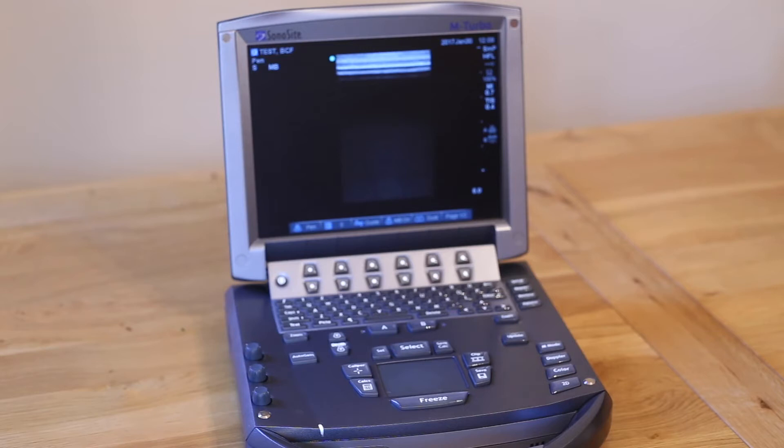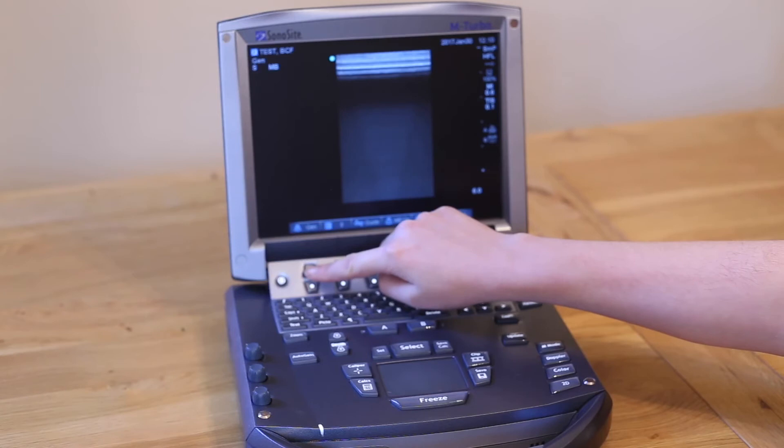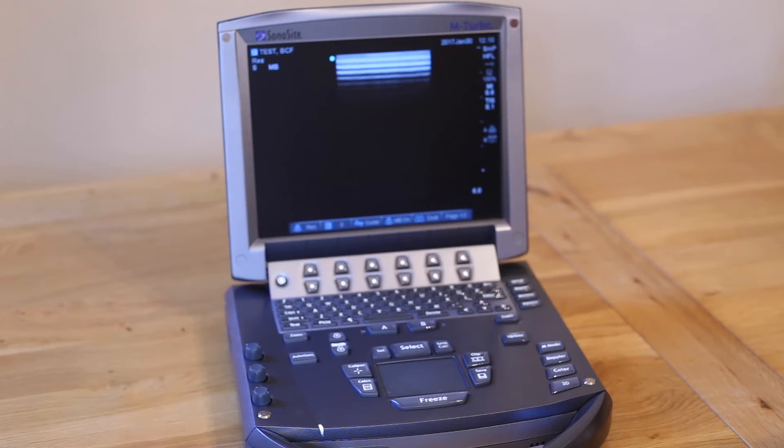Always aim for the highest frequency you can and reduce when scanning deeper. The exact megahertz of each setting will depend on the probe you are using. Always try to remember to adjust your frequency as you adjust your depth to ensure you have an optimised image.